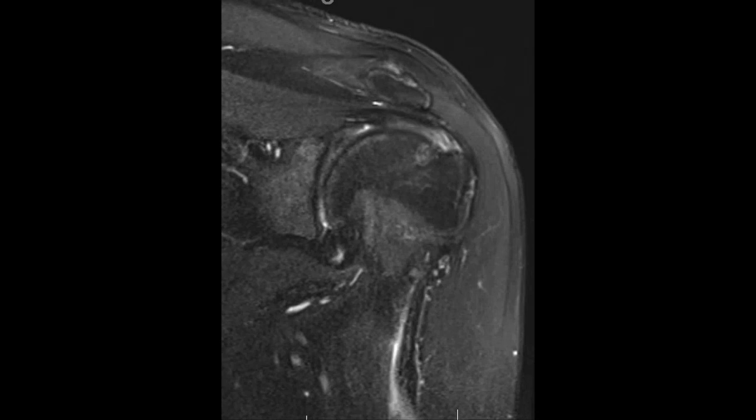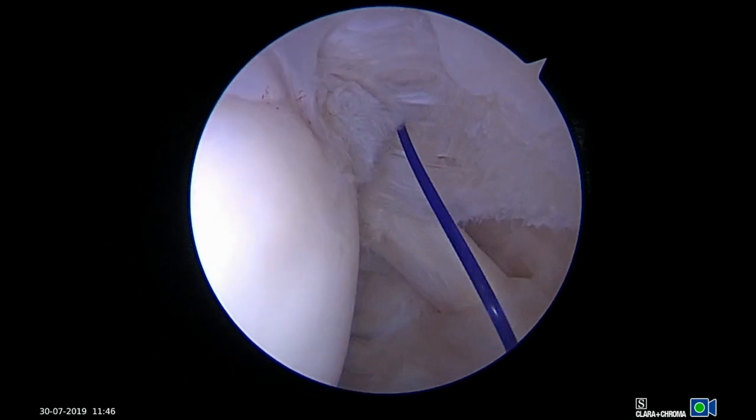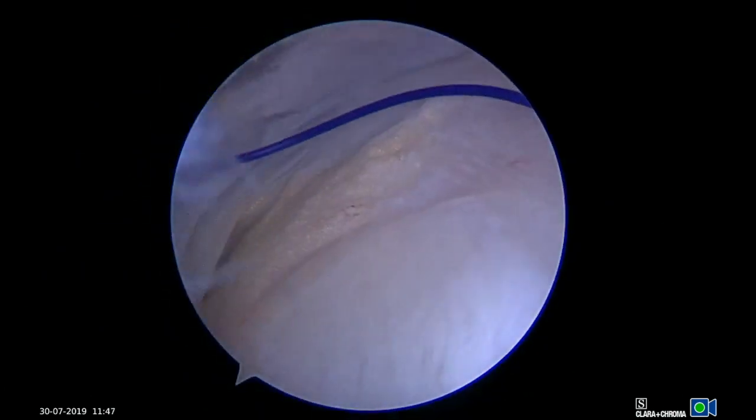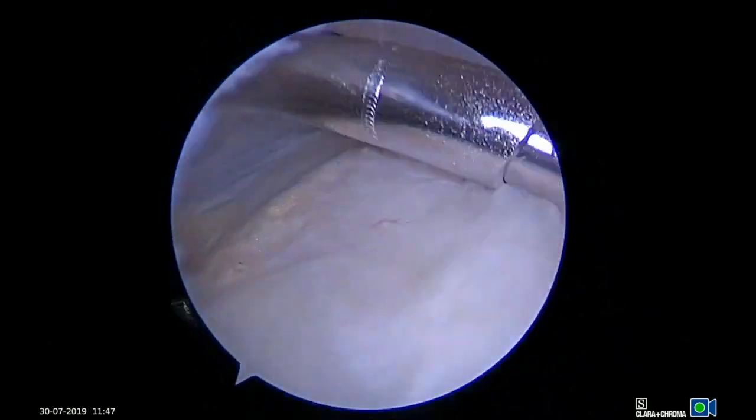Our patient is a 53-year-old male whose MRI demonstrates a pasta lesion. Shown is a right shoulder in lateral decubitus position using a 30-degree arthroscope viewing through a standard posterior portal. The location of the pasta lesion is marked using an 18-gauge needle and PDS suture.